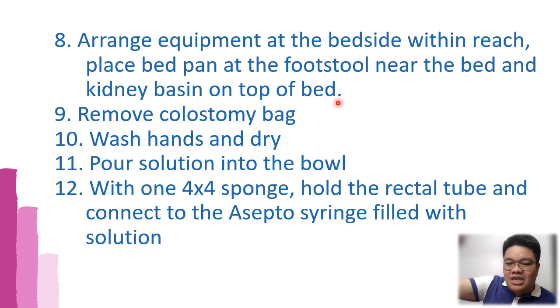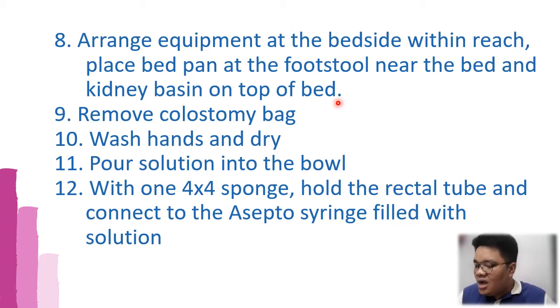When I say within reach, that should be within your arm reach. And you need to be careful that your hands will not be crossing each other, and should not be crossing across your abdomen, so that you're preventing the spread of infection.